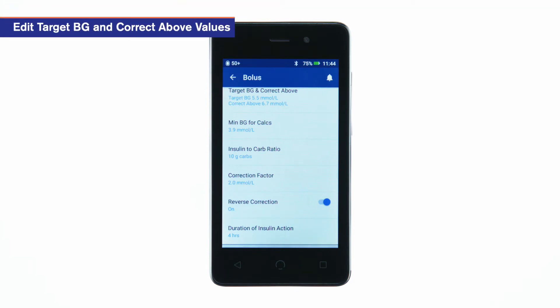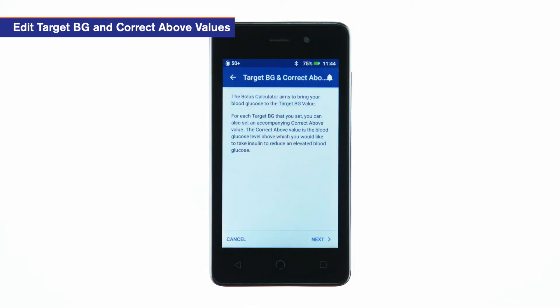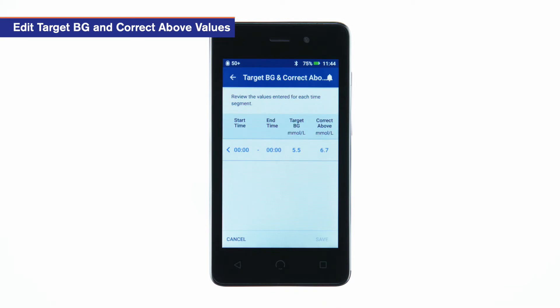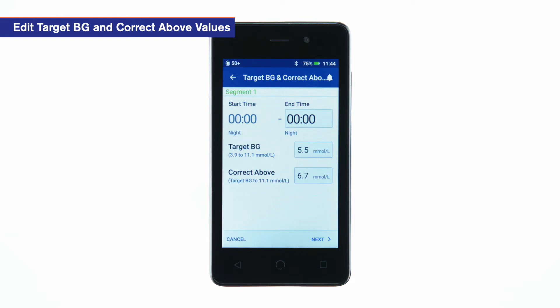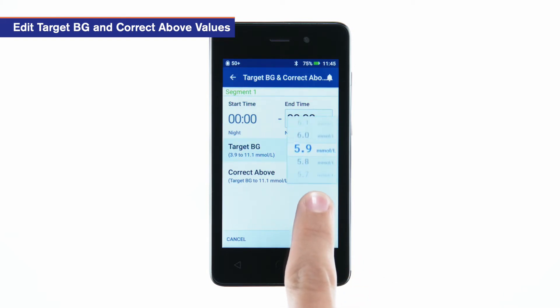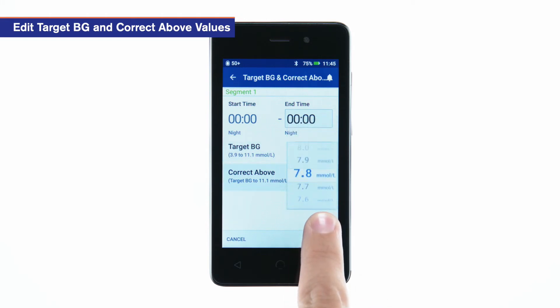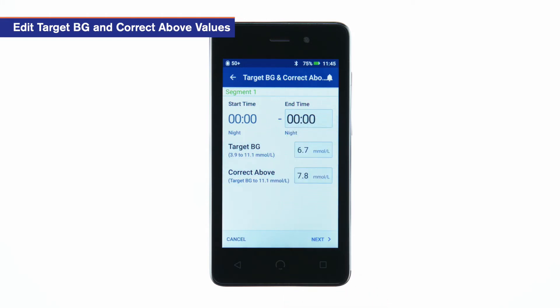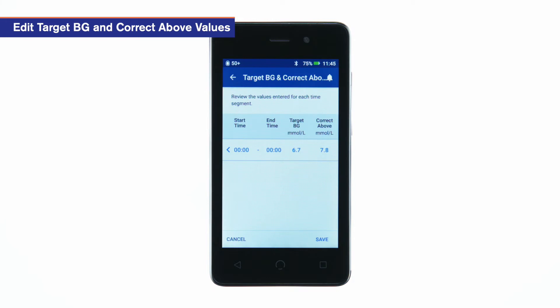Tap target BG and correct above. Tap next. To edit a segment, tap the row containing the segment you want to edit. Adjust the end time, target BG, and correct above values as desired. Tap next. Repeat these steps as needed for the remaining segments. After confirming all segments are correct, tap save.